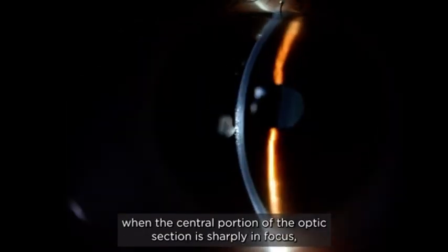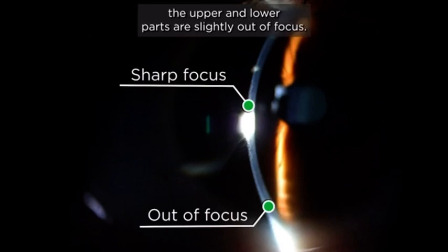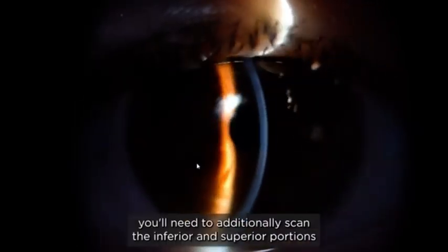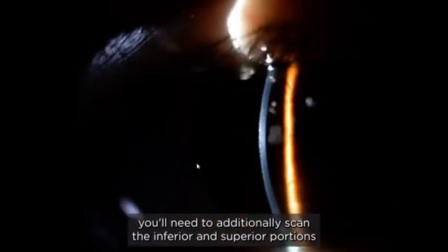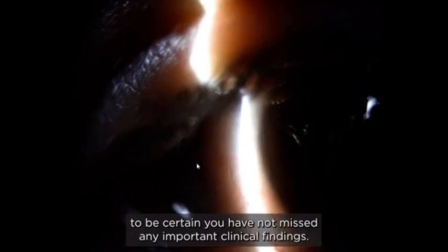Notice that because of the curvature of the cornea, when the central portion of the optic section is sharply in focus, the upper and lower parts are slightly out of focus. Once you have scanned the central cornea, you'll need to additionally scan the inferior and superior portions to be certain you have not missed any important clinical findings.